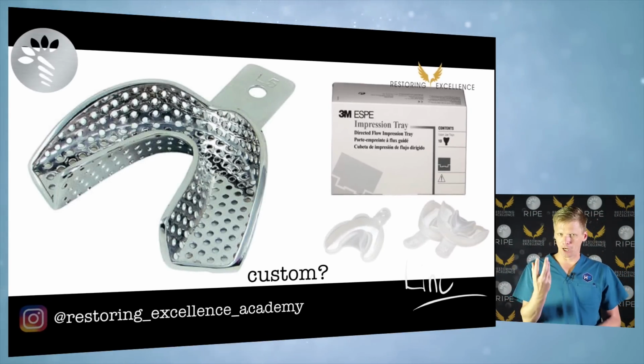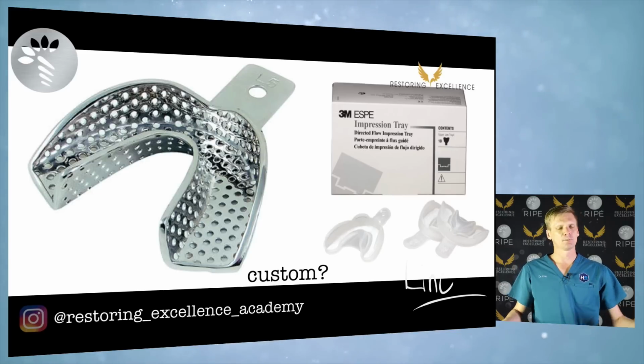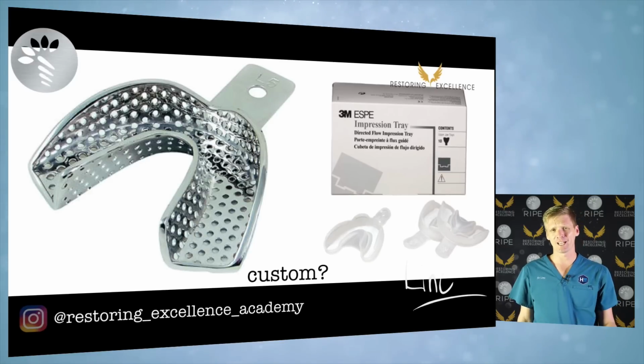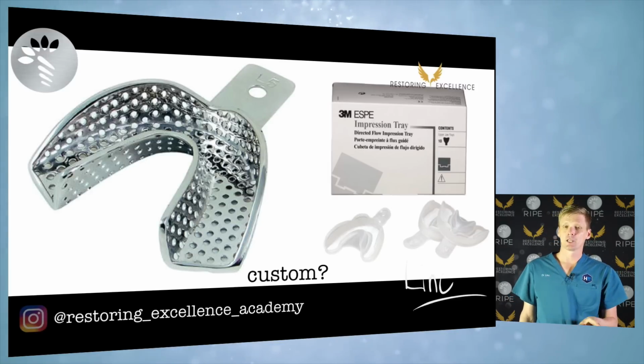So obviously before you take, if you're going to use a metal tray with putty or heavy body, look for black triangles. If there's more than about 7 or 8 black triangles, you ain't never getting that impression out unless you are a beast. And if the patient's got any sort of mobility, they'll have an extra grade of mobility once you finish. So that's my only concern with metal trays.